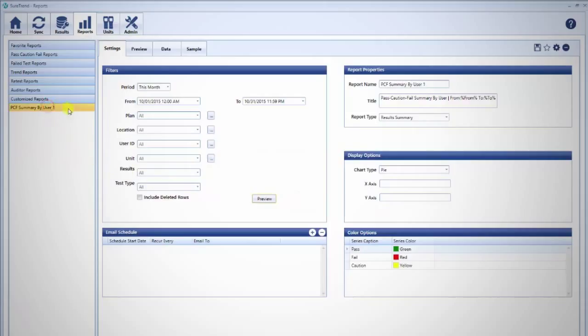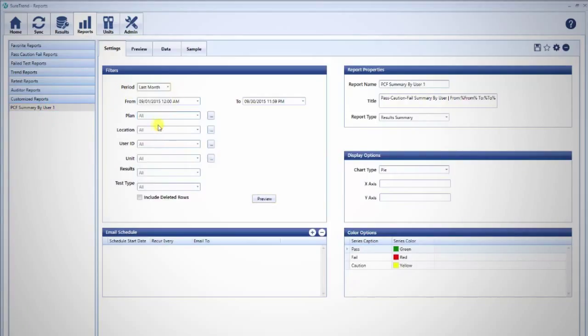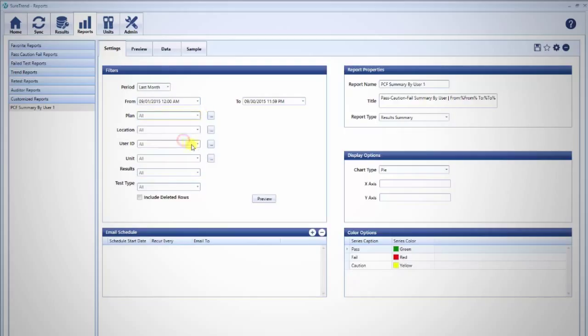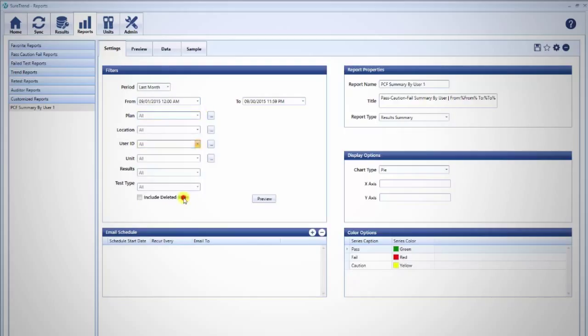On the Settings tab, you can add additional filters. For example, if you are interested in only a particular test plan or user's results, you can filter for those selections here.